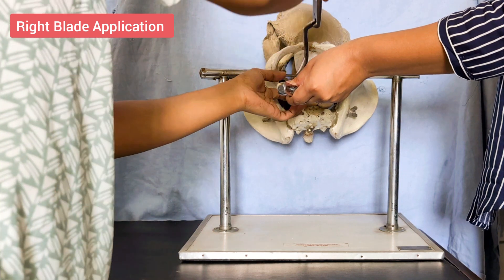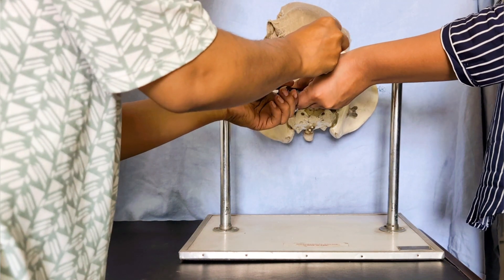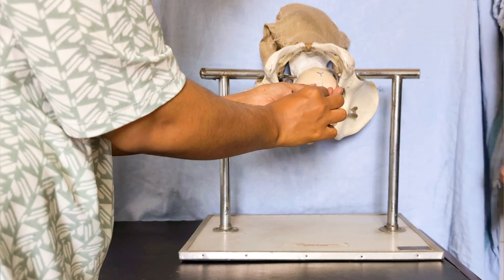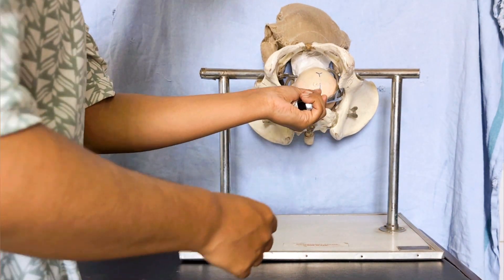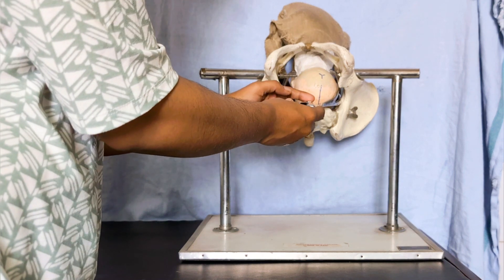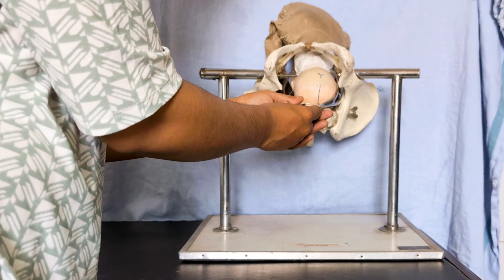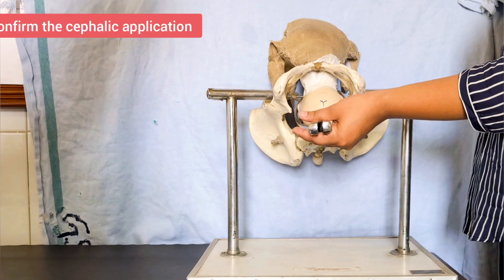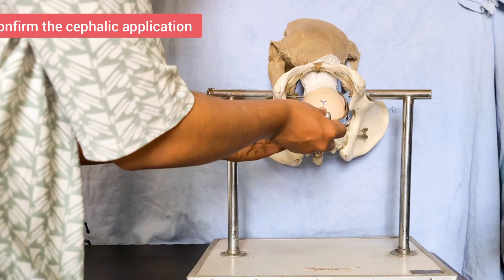After placing the left blade, ask the assistant to hold it. Then apply the right blade the same way — holding it in the right hand while the left hand helps guide it. Then lock the two blades together. Easy locking confirms that it is a correct cephalic application.